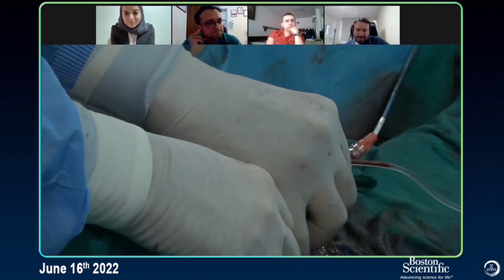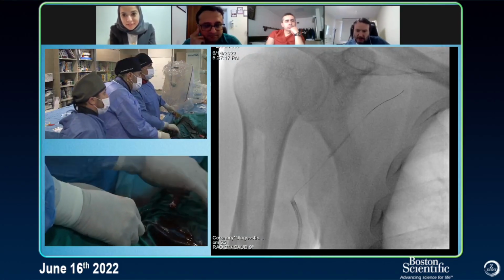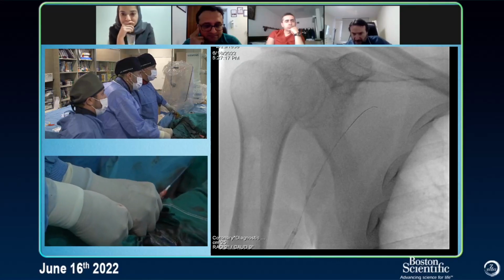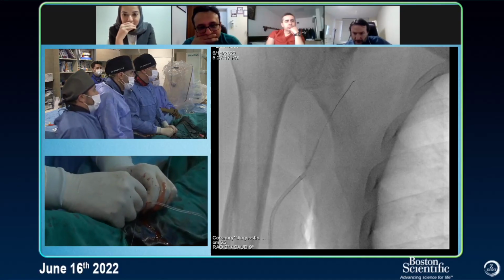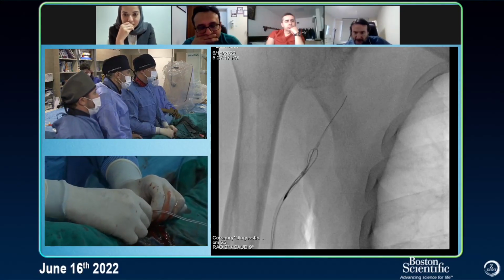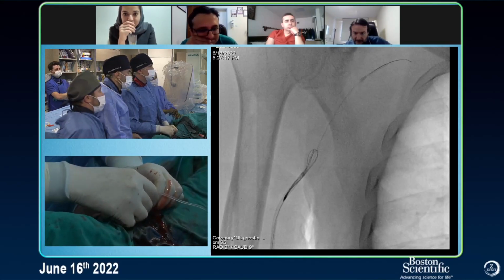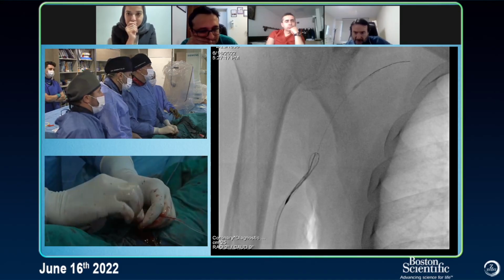All right. Now you are in the brachial artery. You are luckier than me, I think. Now in the axillary artery, I think. It is coming. That's it. Be careful because the wire might be off of the stent at this point.